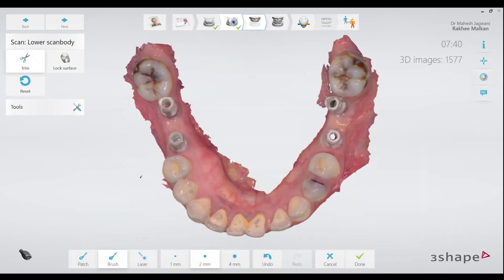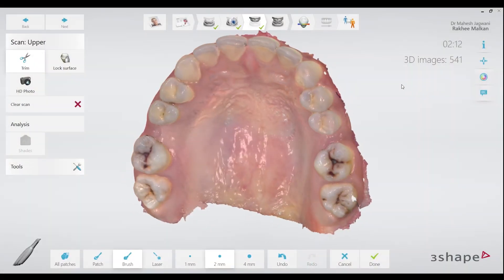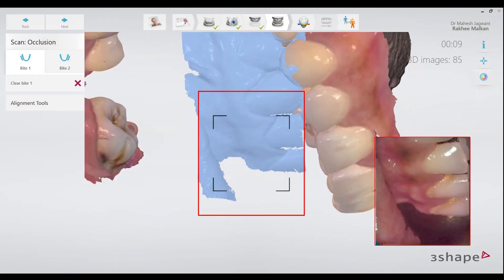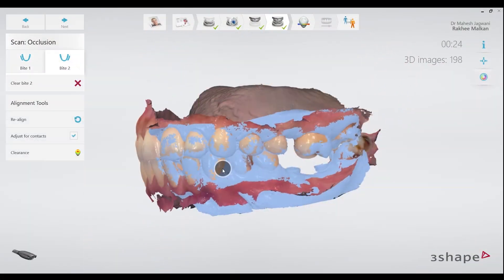My lower scan is ready and I can now go ahead with scanning the opposing arch. With 3Shape, it's a very seamless experience doing all of these scans, which makes it possible to make implant impressions digitally. I have also removed the scan bodies and replaced the healing abutments back so that I can scan the patient's occlusion on both sides.